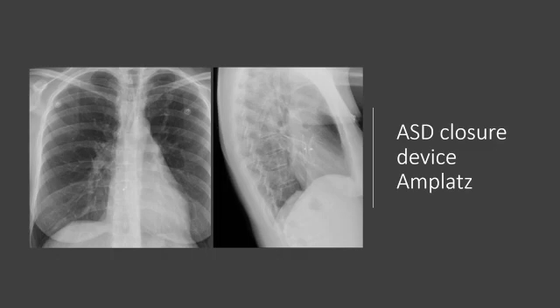This device is made of a nickel-titanium alloy, also called nitinol, which is mildly radiopaque and can be very difficult to see. But if you look at the lateral view, you can clearly make out the outline.